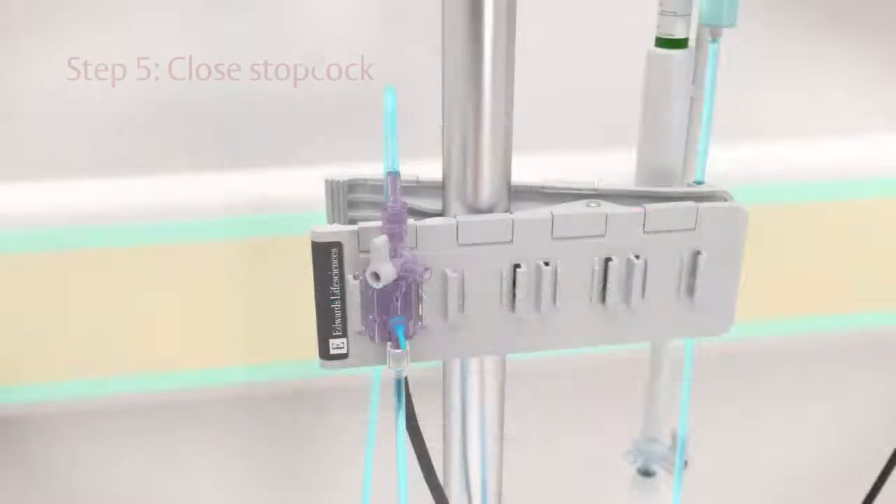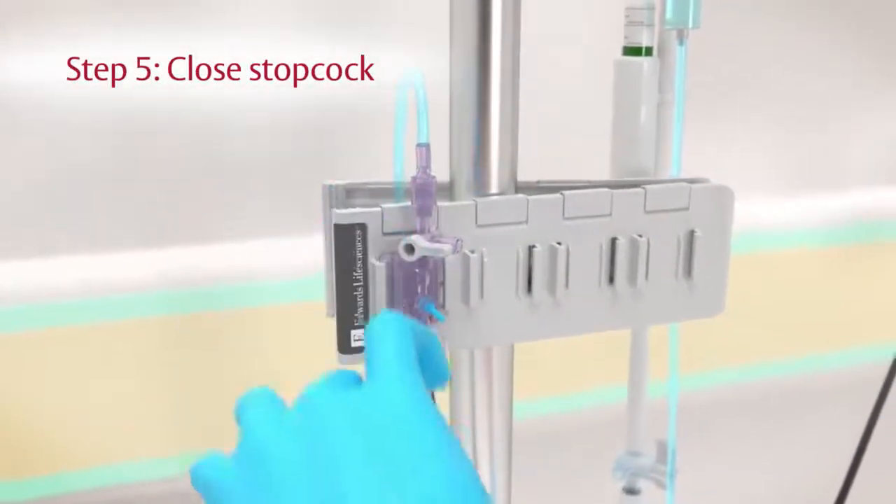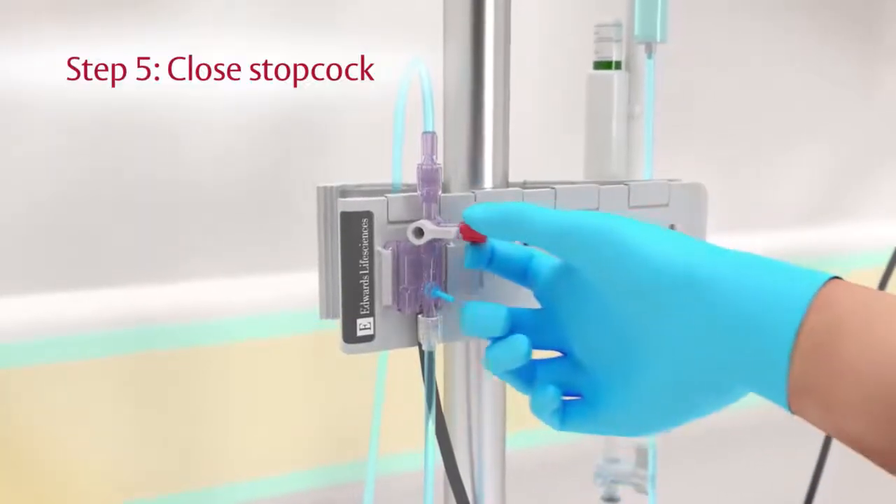Step 5. Close the stopcock on the TruWave transducer toward the vent port and then return the non-vented cap.